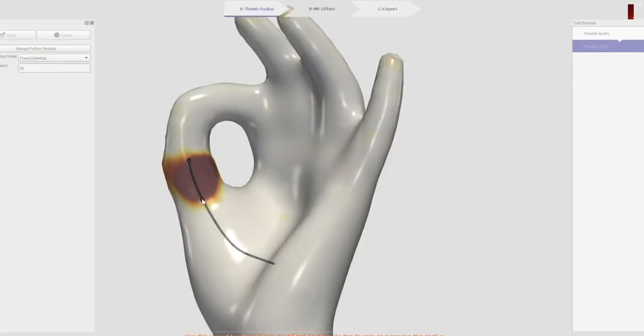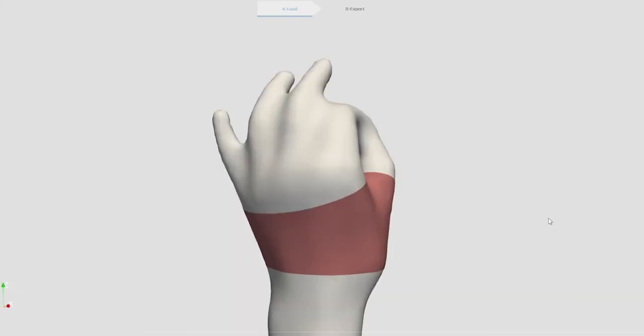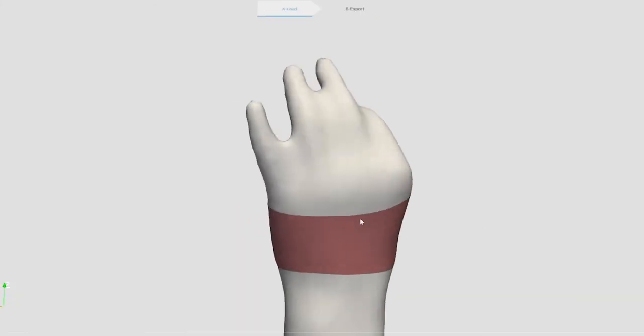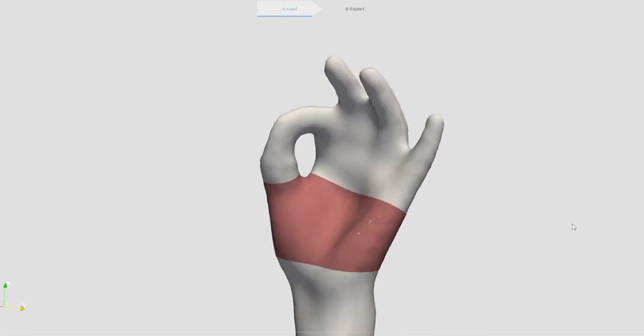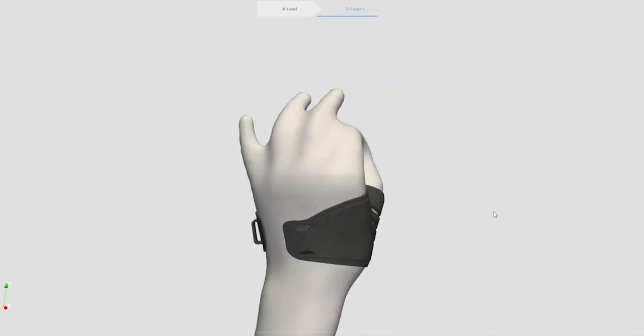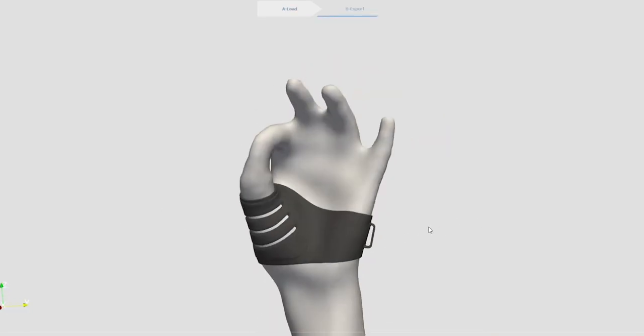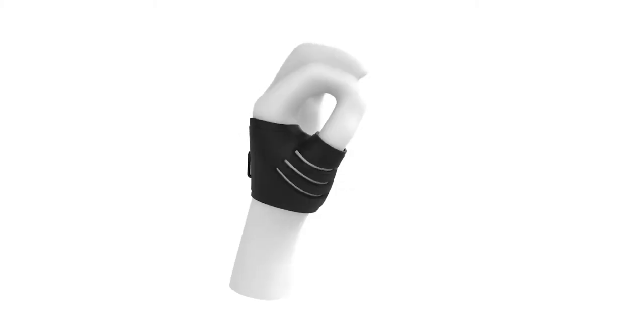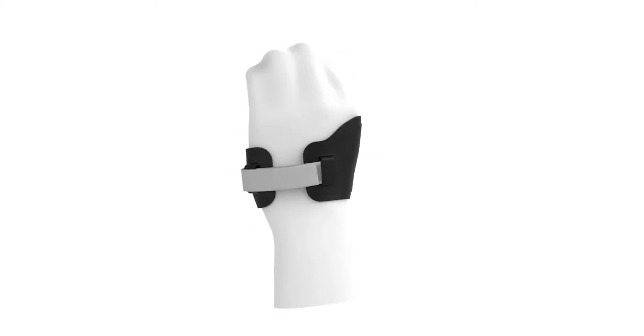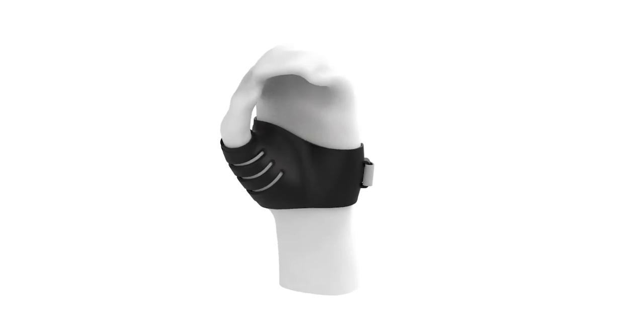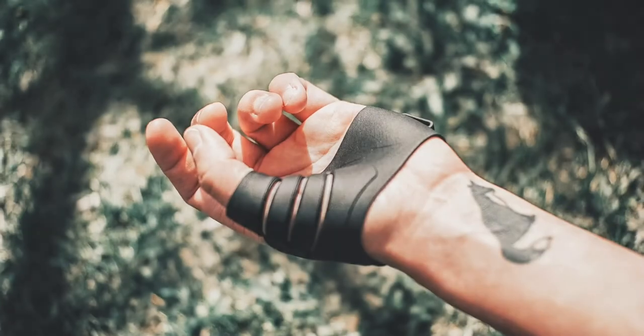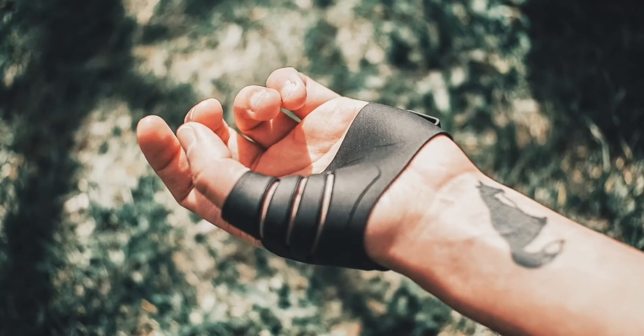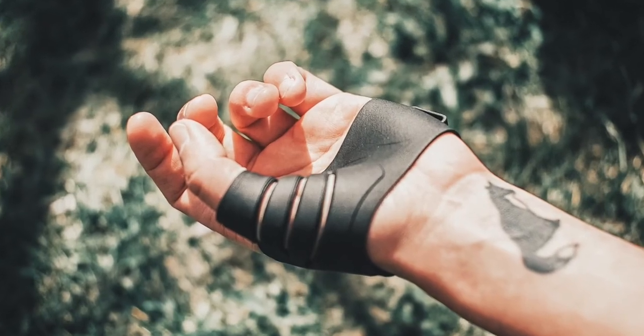This process takes several hours of CAD labor using competing solutions. Our software is entirely automated and in a few minutes allows our clients and innovative manufacturers to go from a 3D scan to a custom fitted product.